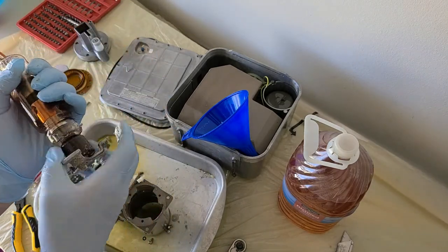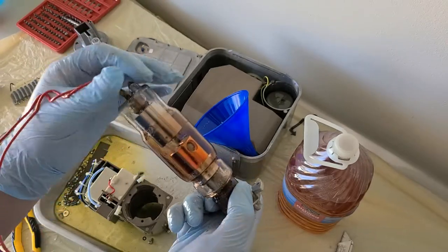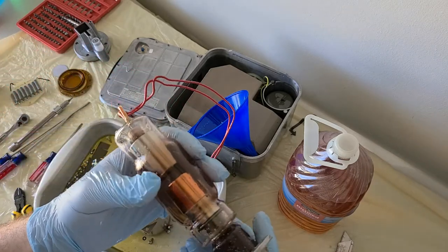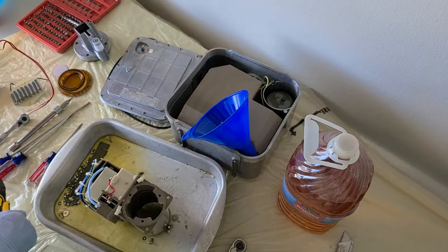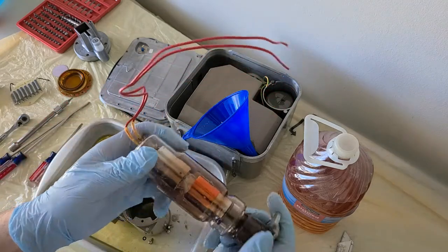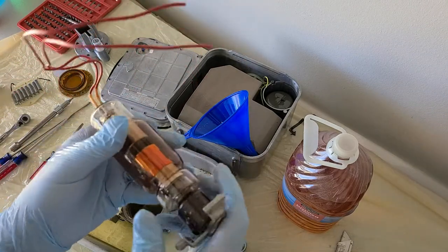Here it is. There's the small Panorex unit, little dental tube. Cut those cables a little shorter. Yeah, pretty neat. Probably just take the cables off, to be honest, even though I can make it glow with the cables. I'll check that out real quick. So yeah, there's the tube. I'll get it cleaned up a little bit and we'll take a closer look at it.